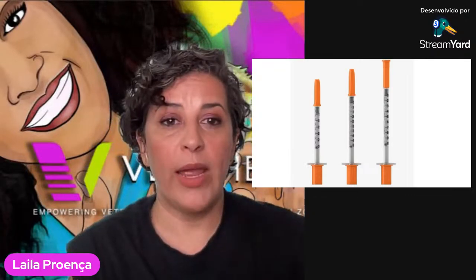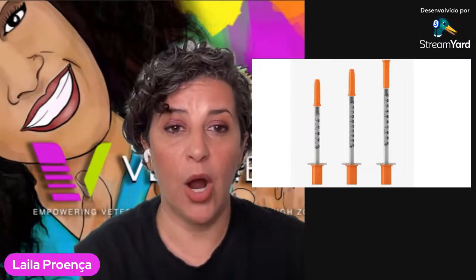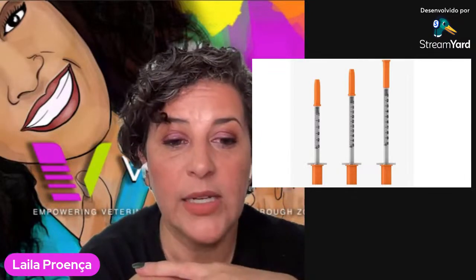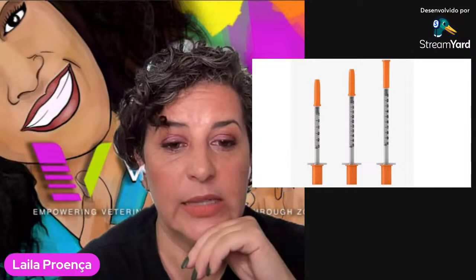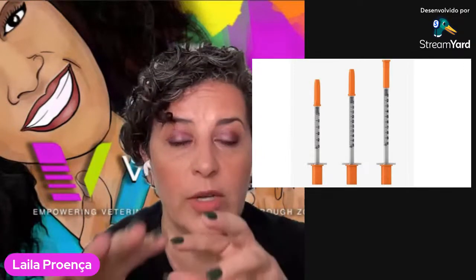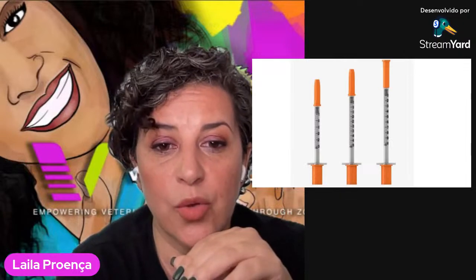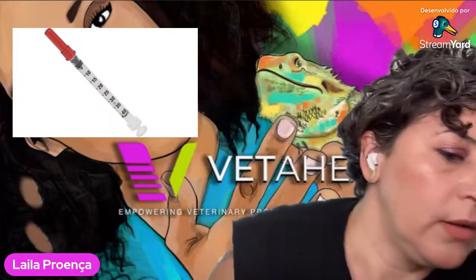Now, when we are talking about the syringes, some of them are 0.3 mLs, some of them are 0.5 mLs, some of them are 1 mL. What you need to have in consideration here is that there are also the syringes called U40s. I want to call your attention to this because the U40s usually have 40 total units. See that?